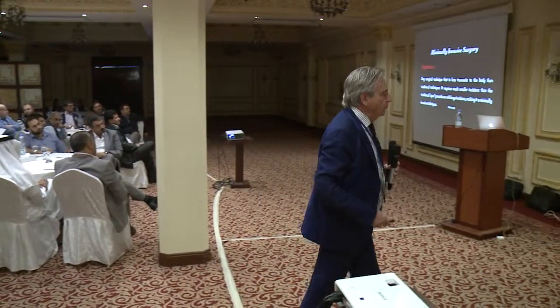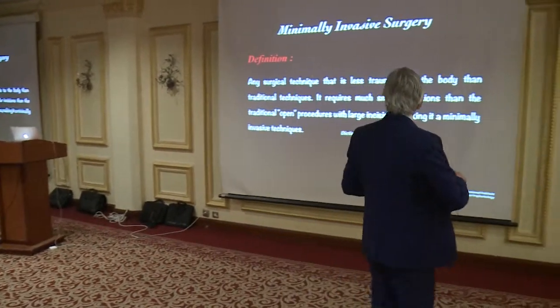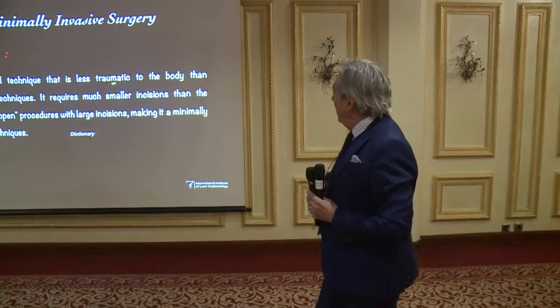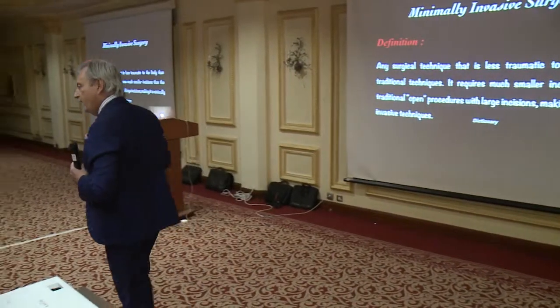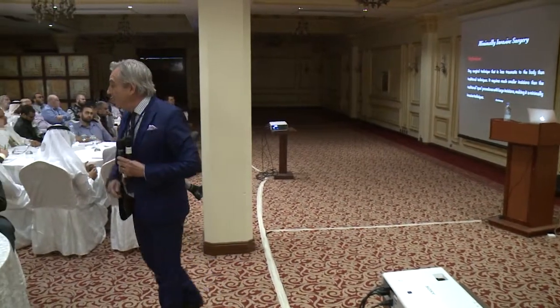MIS, minimally invasive surgery, is well known in different specialties of medicine. And this is what the dictionary gives as definition: any surgical technique that is less traumatic to the body than traditional, with smaller incision than the traditional open procedure. But do you think that it's limited to this definition, MIS? Not really.